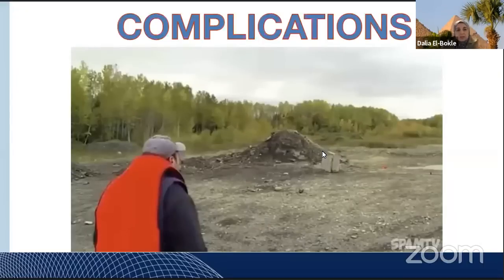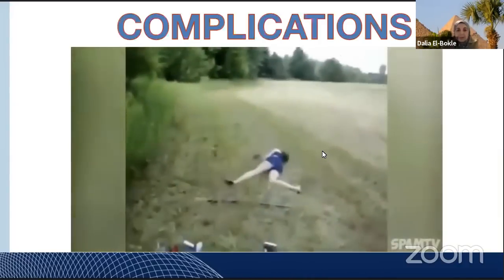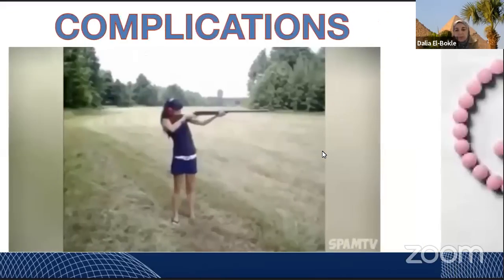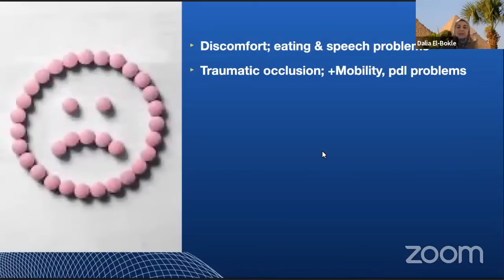So now let's go to the complications. Yes, it can fire back. If you use it improperly, it can fire back. And let's see how. The first thing, bite turbos can cause discomfort during eating and speech problems, especially when placed in the beginning of treatment.